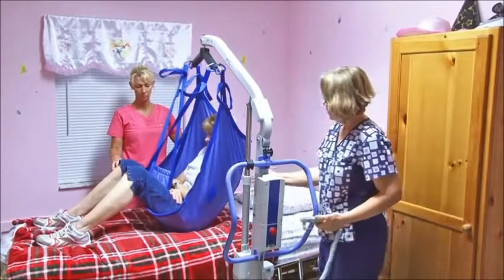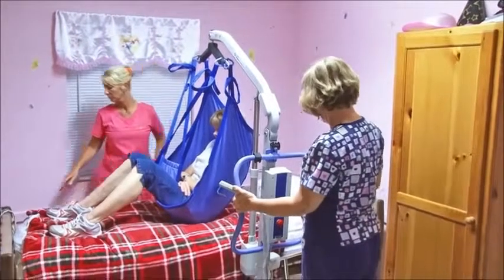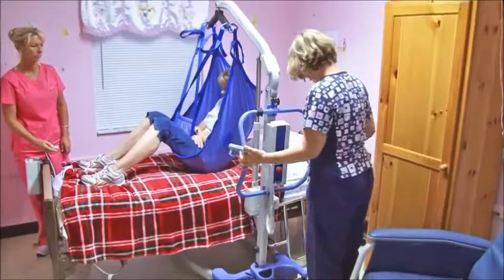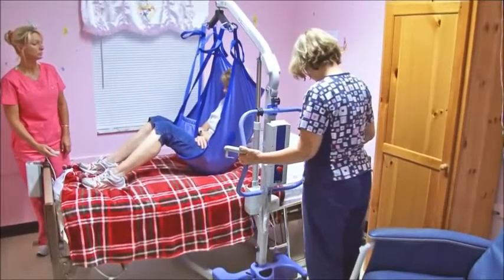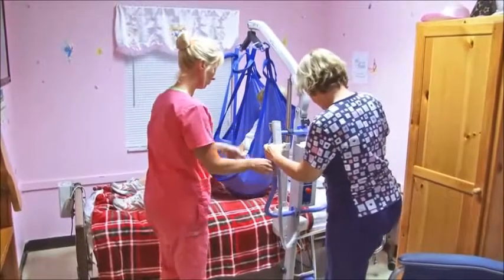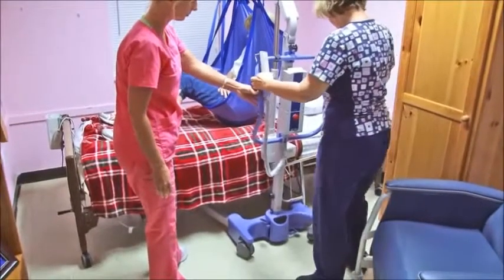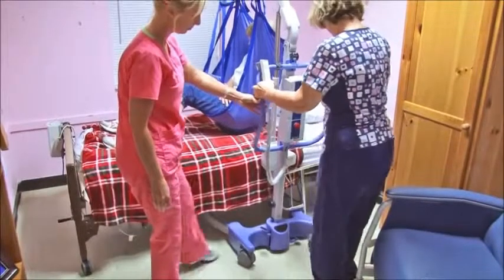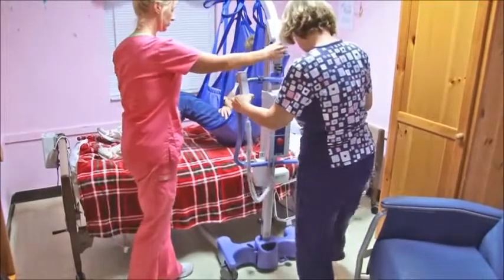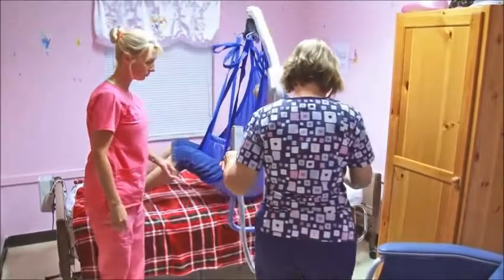Now, in this case, we have to lower the bed a little bit more because we did have to raise it slightly for the leg on the other side. Now, we're going to unlock and move her over to the side. You have to come this way. So I am maneuvering it.